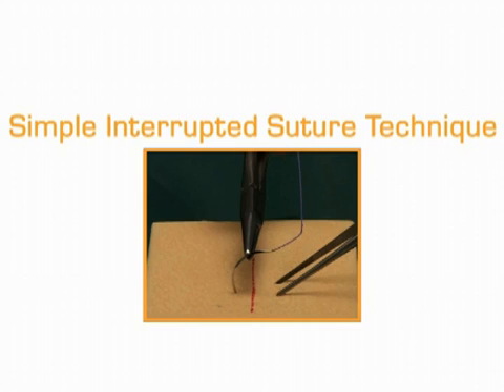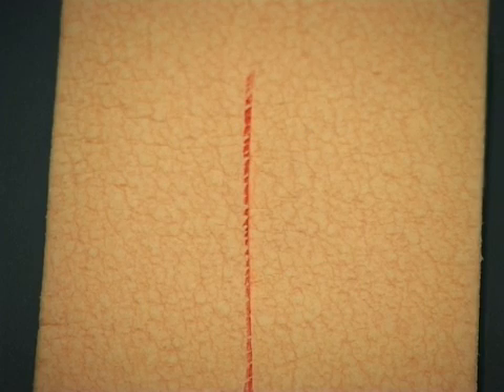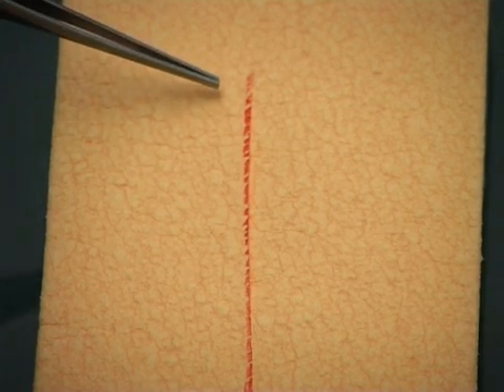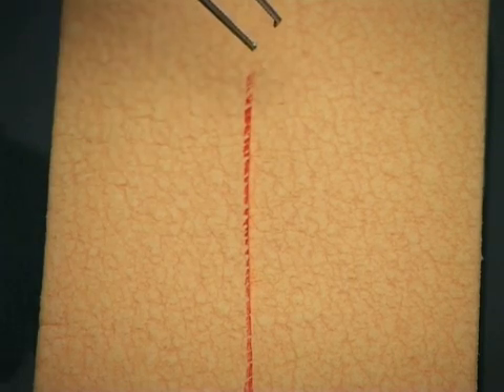In this segment, we take a look at the simple interrupted suturing technique. Start on the side of the wound furthest from you, so that you are suturing towards yourself. Hold up one edge of the wound with the tooth forceps.